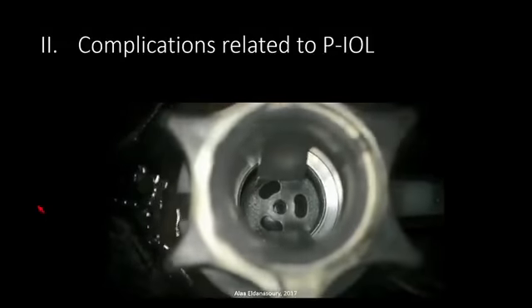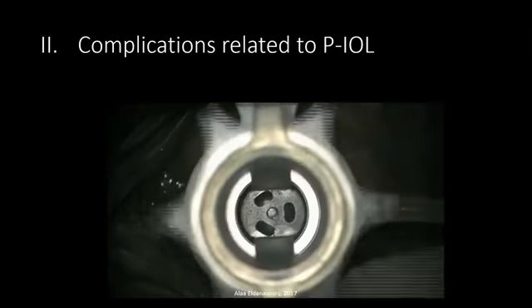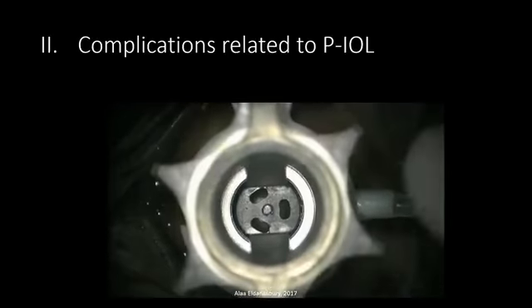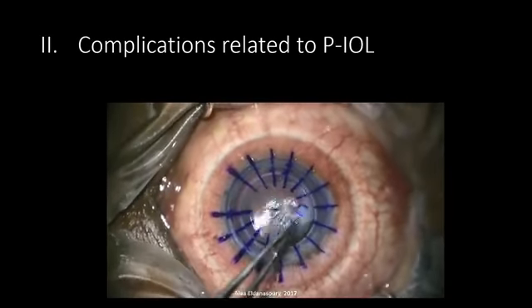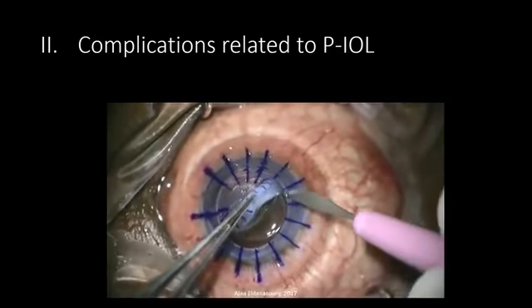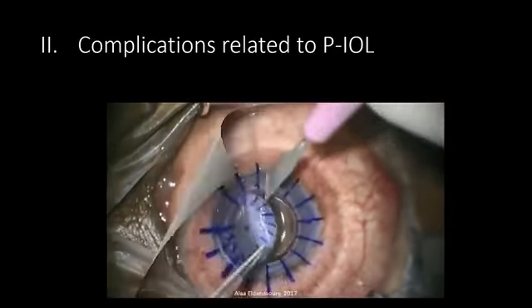Now, the second category of complications is a little bit more dramatic. These are when the surgeon does not follow the proper selection criteria. This is one of the old Phakic angle-supported lenses, and I'm proud not to have done a single case of angle-supported lenses in my career.